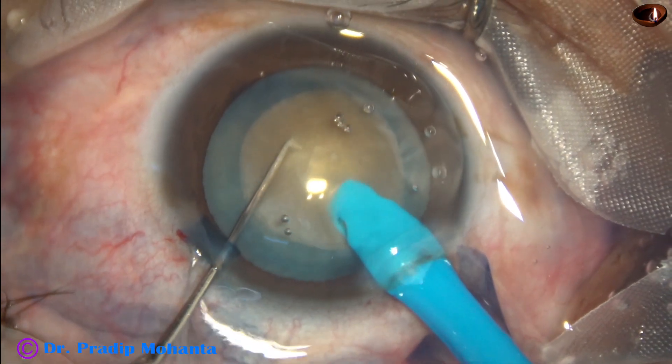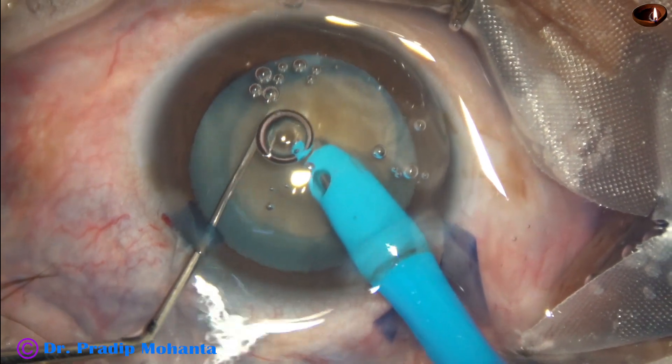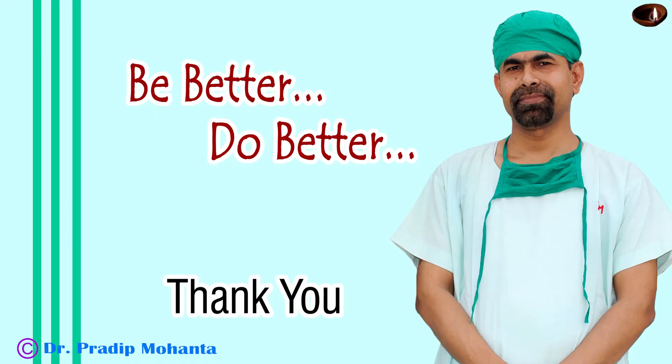In this case, you have seen that with bevel down I made a tunnel, then I released the mass, made the phaco needle with its bevel up, entered into the tunnel, and made the crack. So this is a nice way to divide such free-floating nuclei.